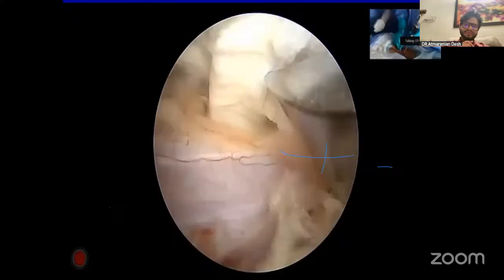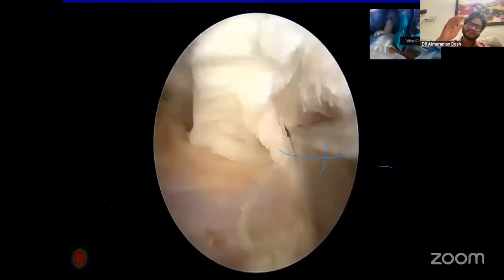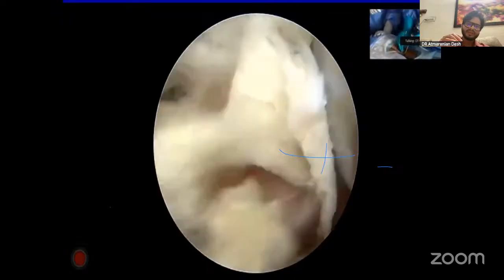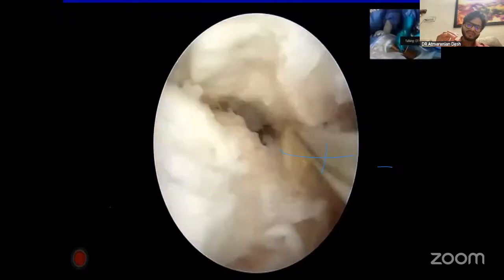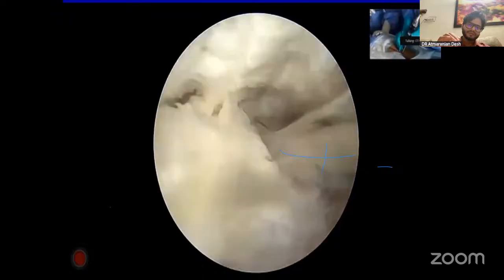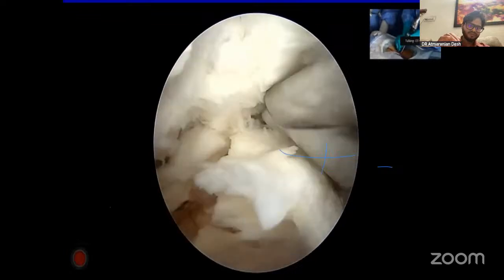Once you do this, you move on to remove the contralateral lip of the cranial border of the caudal lamina, which is the contralateral flavum attachment. Then you remove all the flavum around. We have to take care of the claudication too, so I am removing all of the flavum here.